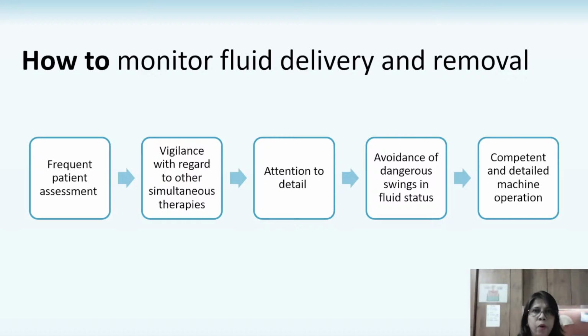Also, we must avoid dangerous fluctuations or wide swings in the fluid status of the patient. And finally, a detailed and complete operation of the machine is essential, and so an experienced technologist must be available.